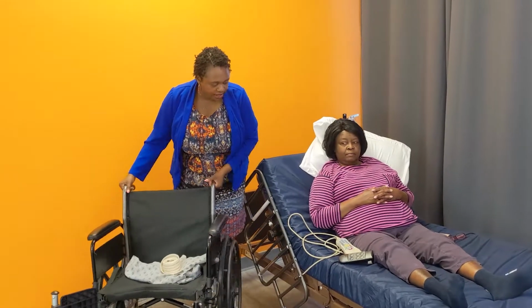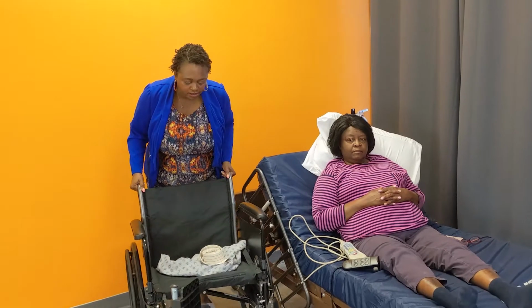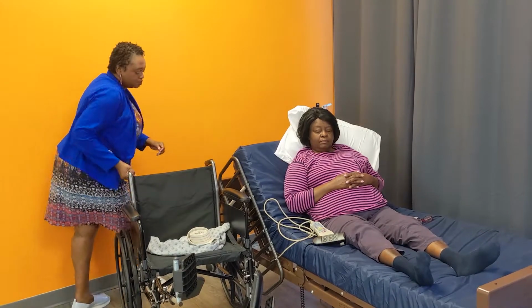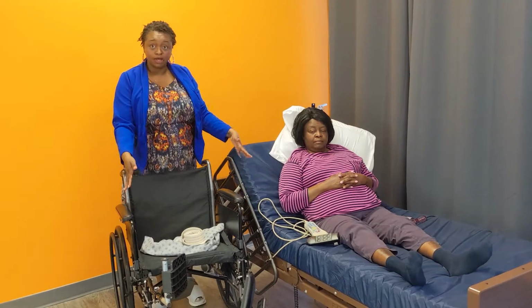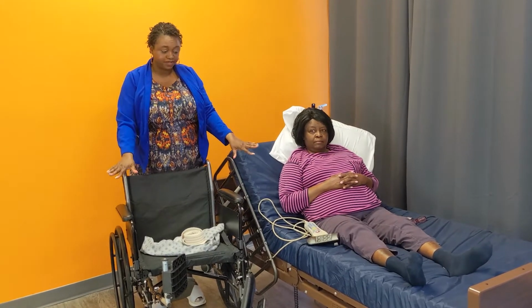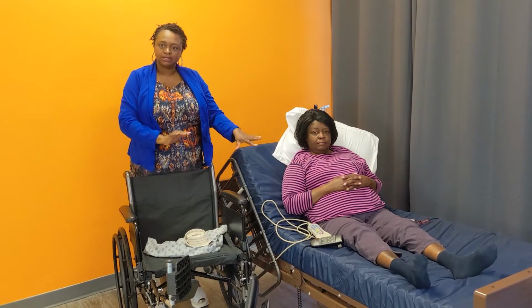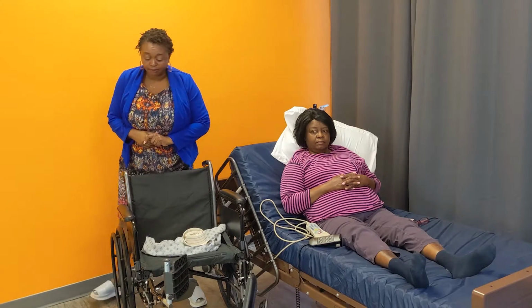And my wheelchair, let's see how we're going to do it here. You take a look at how to position the wheelchair. It might not be perfect at first, but you make sure that you get it as close as possible. So I'm locking the wheelchair for patient safety. And notice I dropped my side rail, but I haven't gone far. Don't leave the room with the side rail down. I'm still right here. So my wheelchair is locked, which is number one.